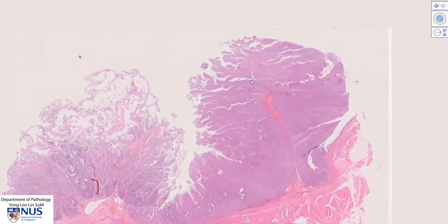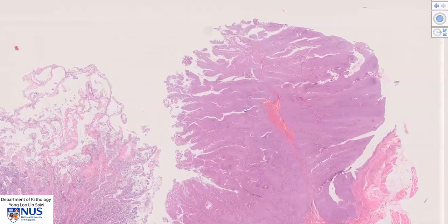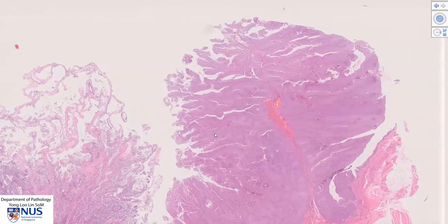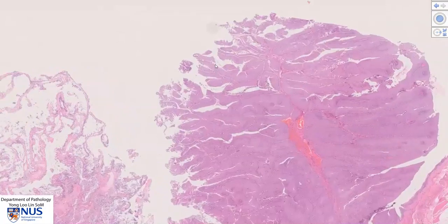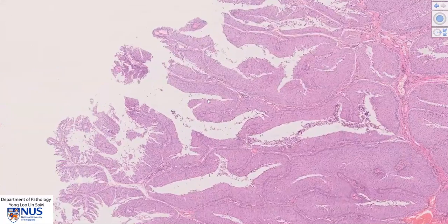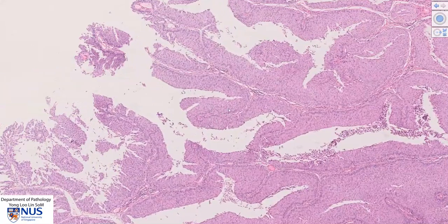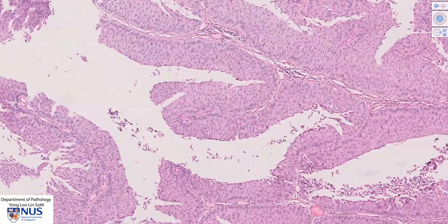We can see that it does have a papillary architecture with these finger-like fronds of tumor projecting into the bladder lumen. Here you can see a finger-like frond with this very delicate fibrovascular central core.